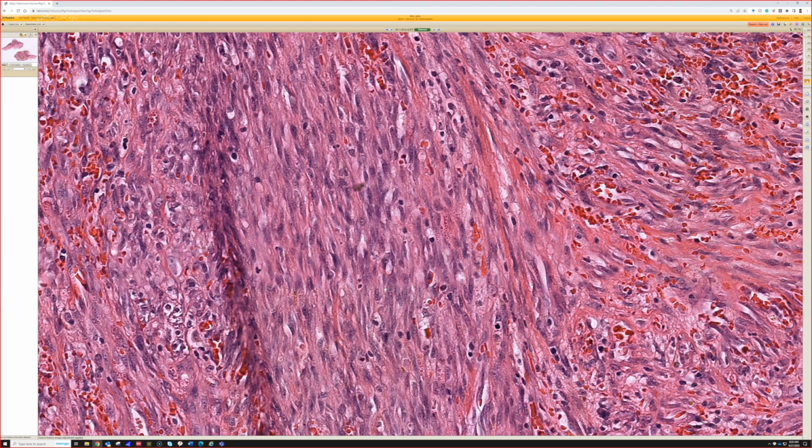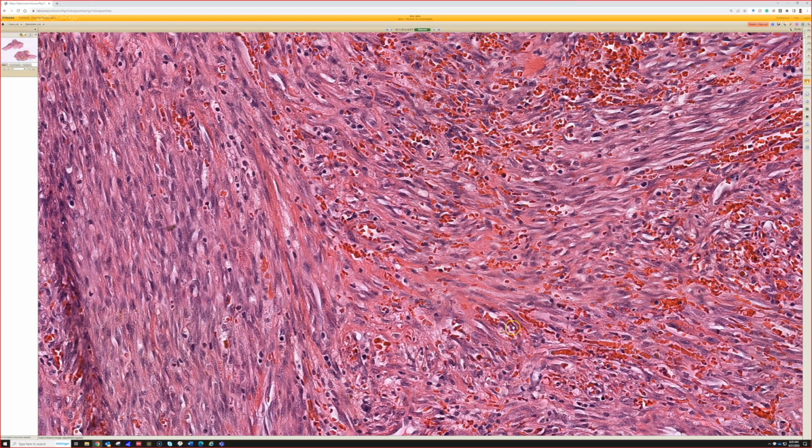If you see something that looks like Kaposi sarcoma, but it's on the head and neck of an older sun-damaged patient, that to me is angiosarcoma until proven otherwise. I don't care how much it looks like Kaposi, unless you prove it to me with the positive HHV8 in that context clinically, it is so much more likely to be angiosarcoma than Kaposi. So clinical context matters a lot.